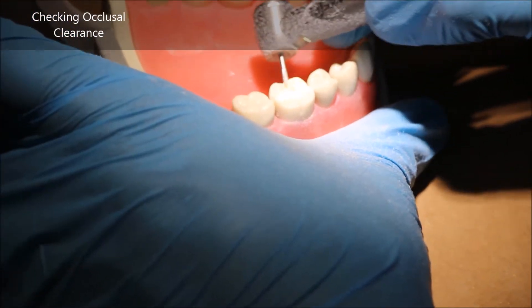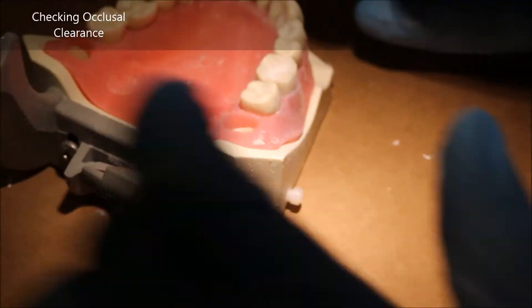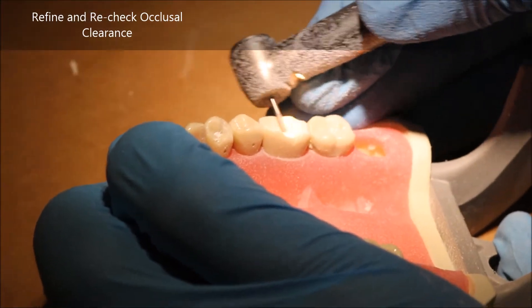At this point, I'm going back and re-emphasizing my functional cusp bevel as well as taking down certain portions of my occlusal table which I did not take down initially as heavily as I should have.